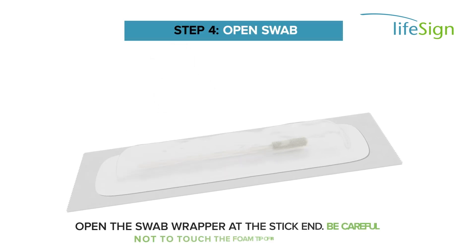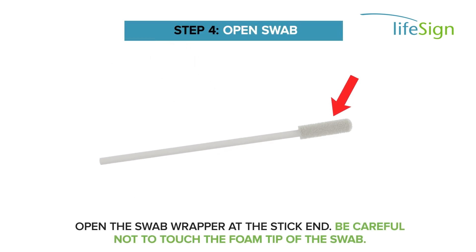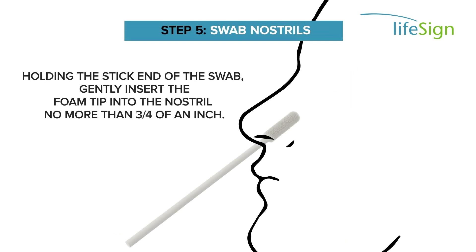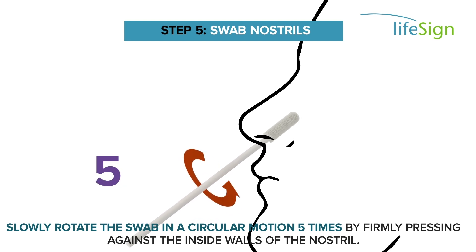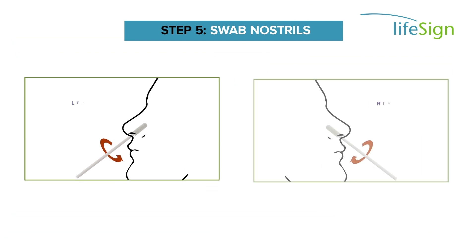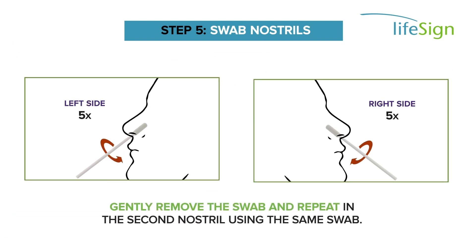Open the swab wrapper at the stick end. Be careful not to touch the foam tip of the swab. Holding the stick end of the swab, gently insert the foam tip into the nostril no more than three-quarters of an inch. Slowly rotate the swab in a circular motion five times by firmly pressing against the inside walls of the nostril.